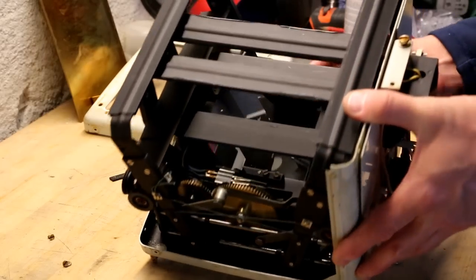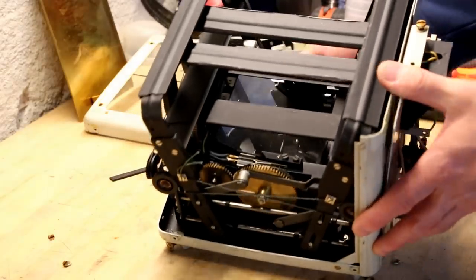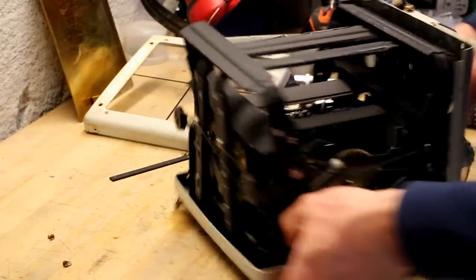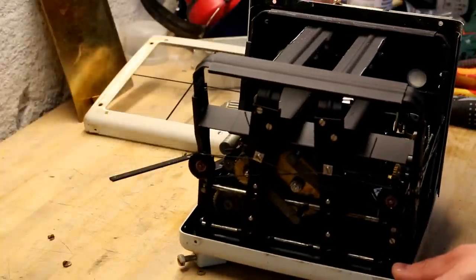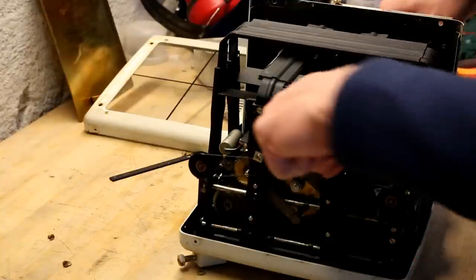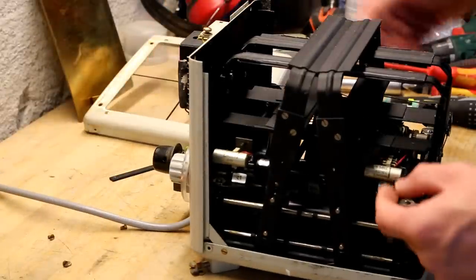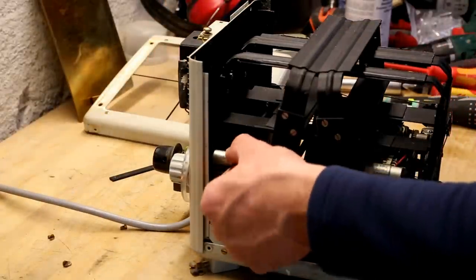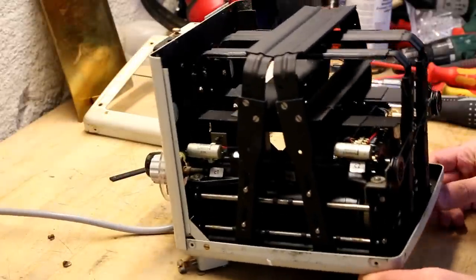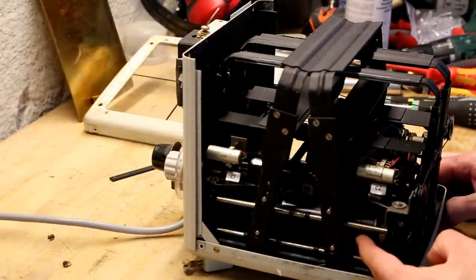Now, if we take a look here at the side, there are some spring contacts here, as well as on this other side here. There's also some end contacts. But then on this side, we have some capacitors, which seem to be in conjunction with... Yeah, there appear to be two motors down here.